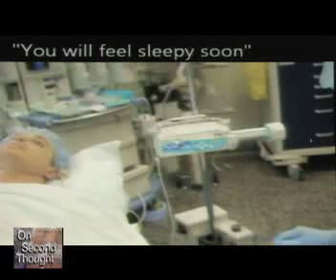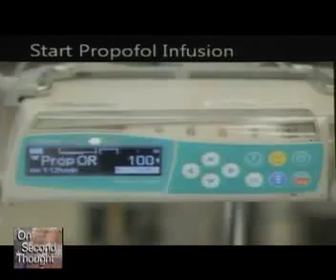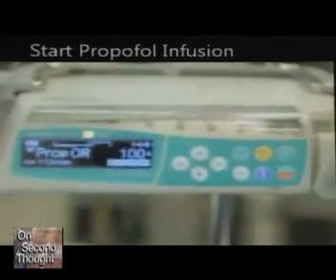Stop. The anesthesiologist is in close communication with the patient. You will feel sleepy very soon. And with that, please continue. The infusion pump is started, shown here. So now propofol is being administered to the patient.